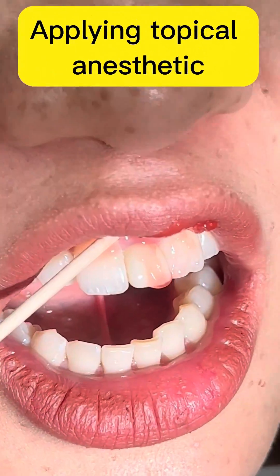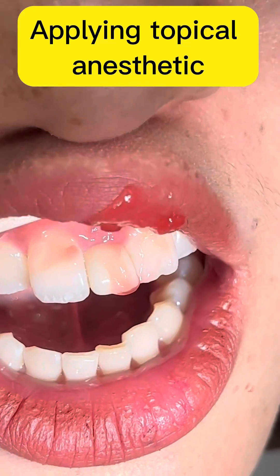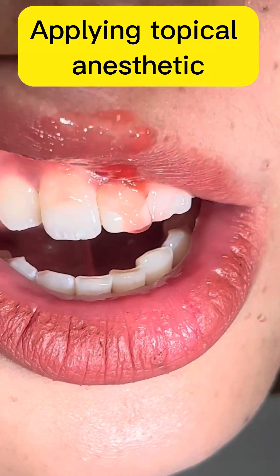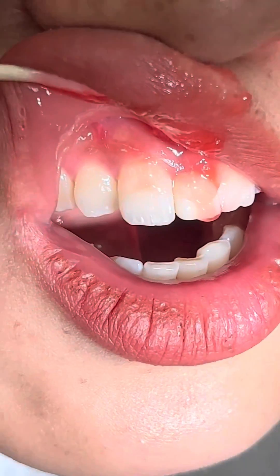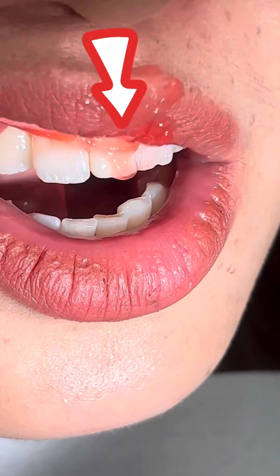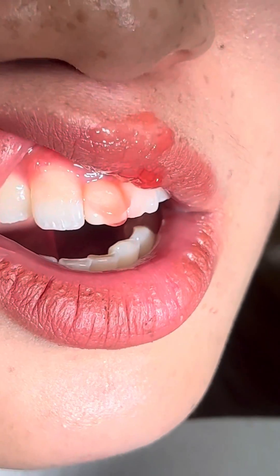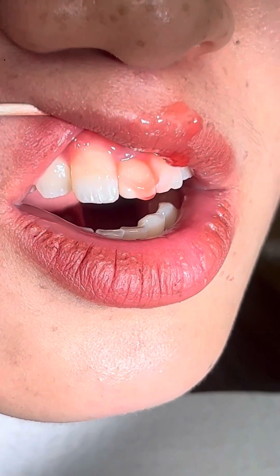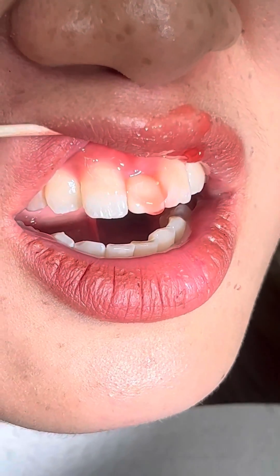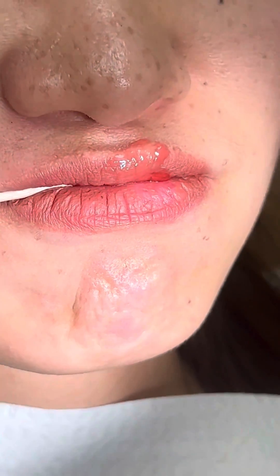Applying topical anesthetic to numb the area around the tooth. Close your lips, close, leave it there.